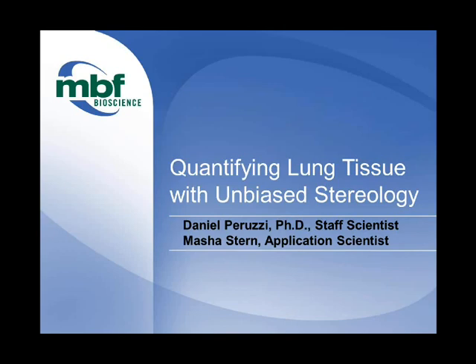My name's Dan Peruzzi, and my colleague Masha Stern and I will be talking to you today about some stereological applications that are useful for lung research.